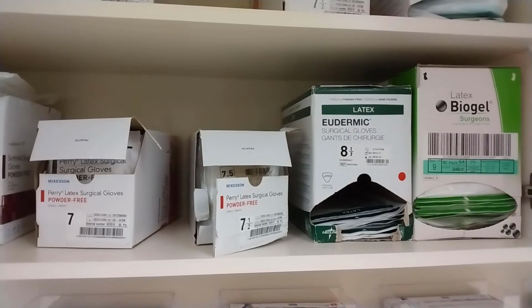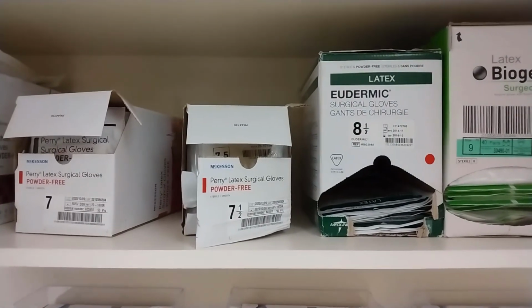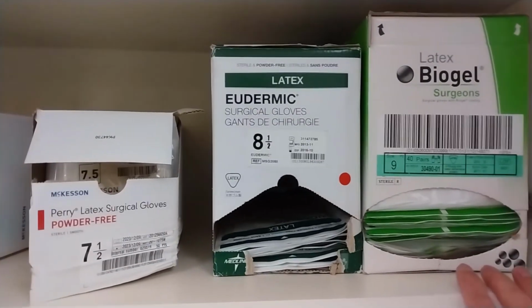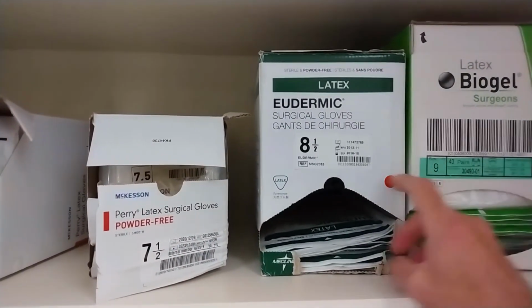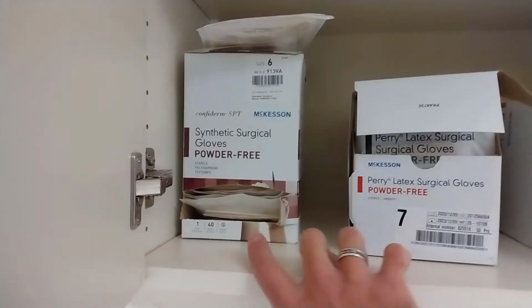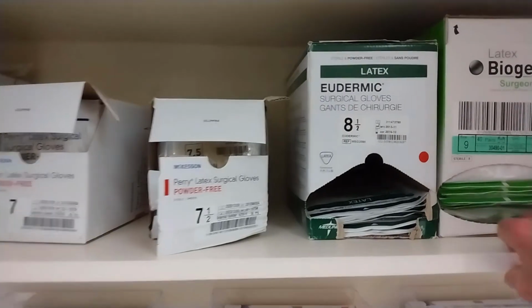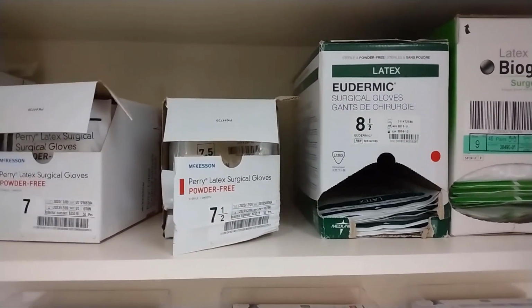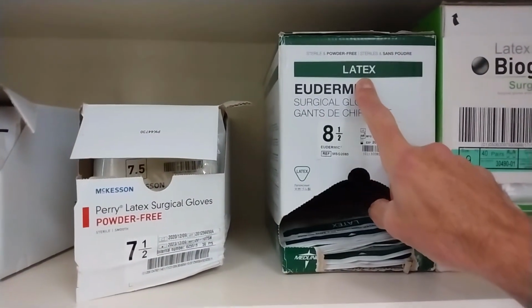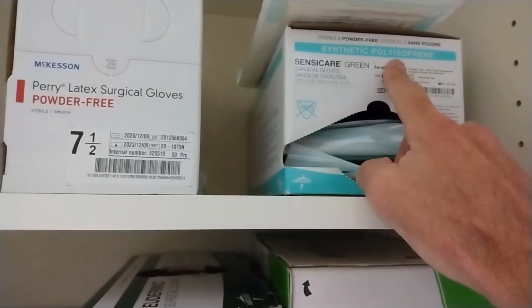Be careful about what kind of gloves you use. As you can see, there's different sizes, and with sterile surgical gloves, it's not just small, medium, large. There's a number. So I'm usually a large. I wear a 9. There's 9s, 8.5, 7.5, 7s, 6s. And this is for our class. So this 6 to 9 pretty much covers everybody. There might be larger sizes. And watch out, because some of these are still made out of latex. These are latex. These are latex. These are something other than latex.